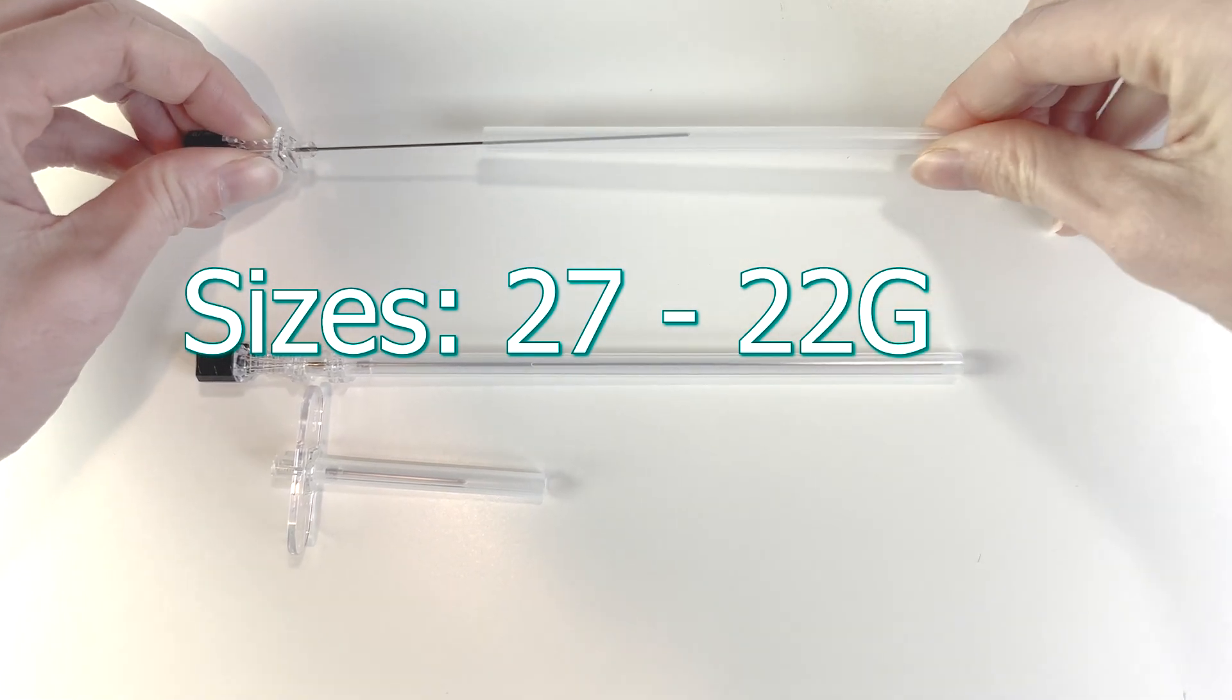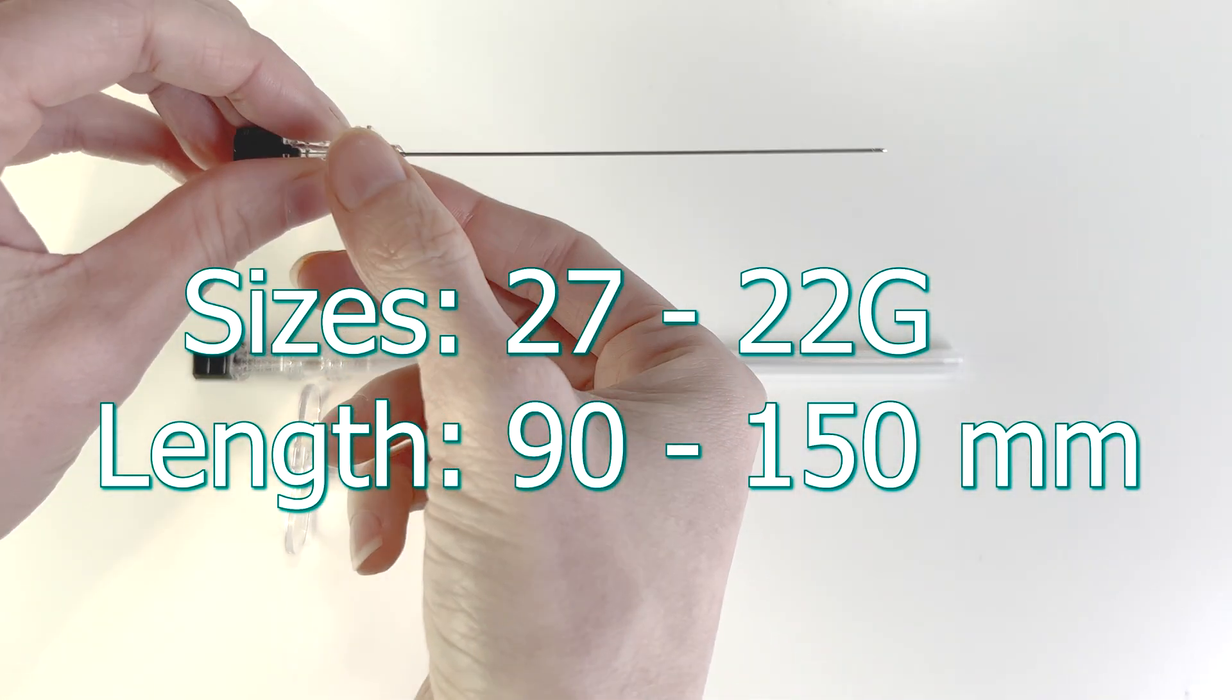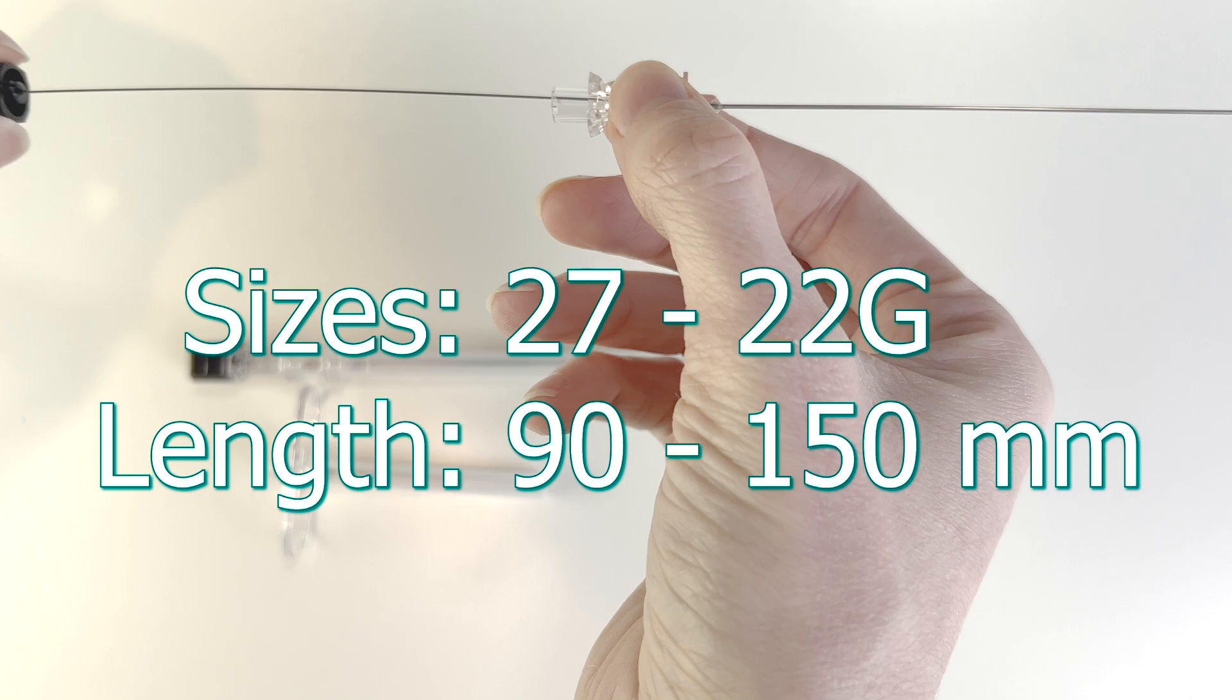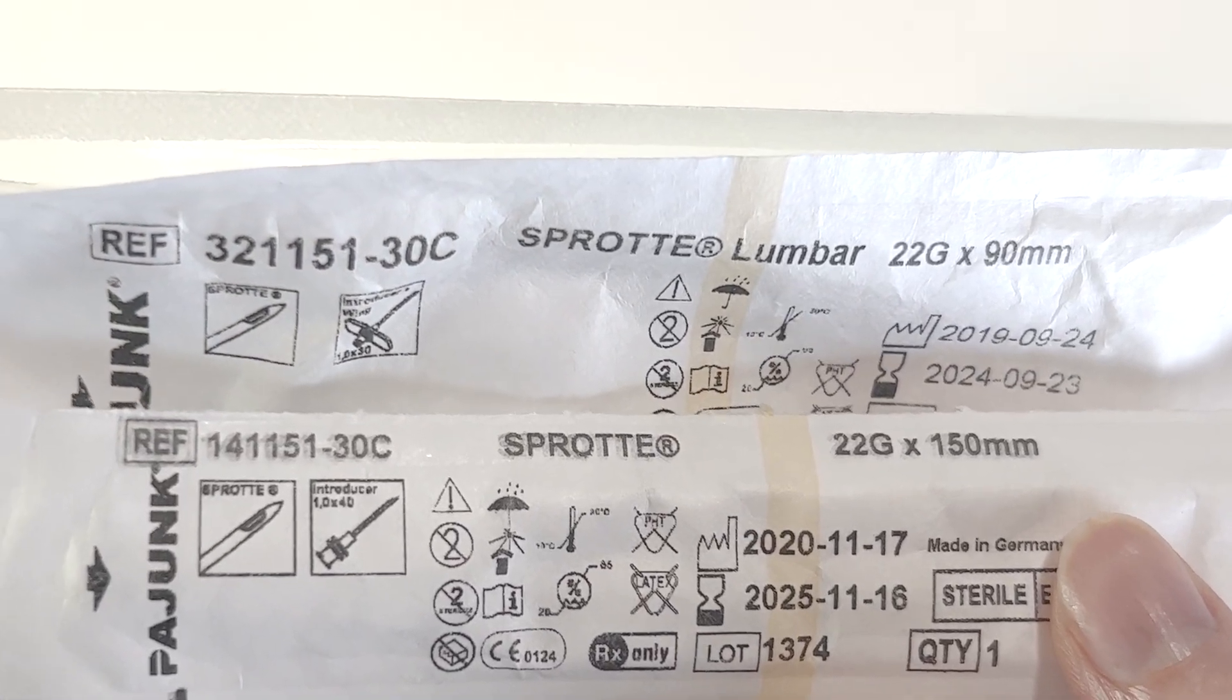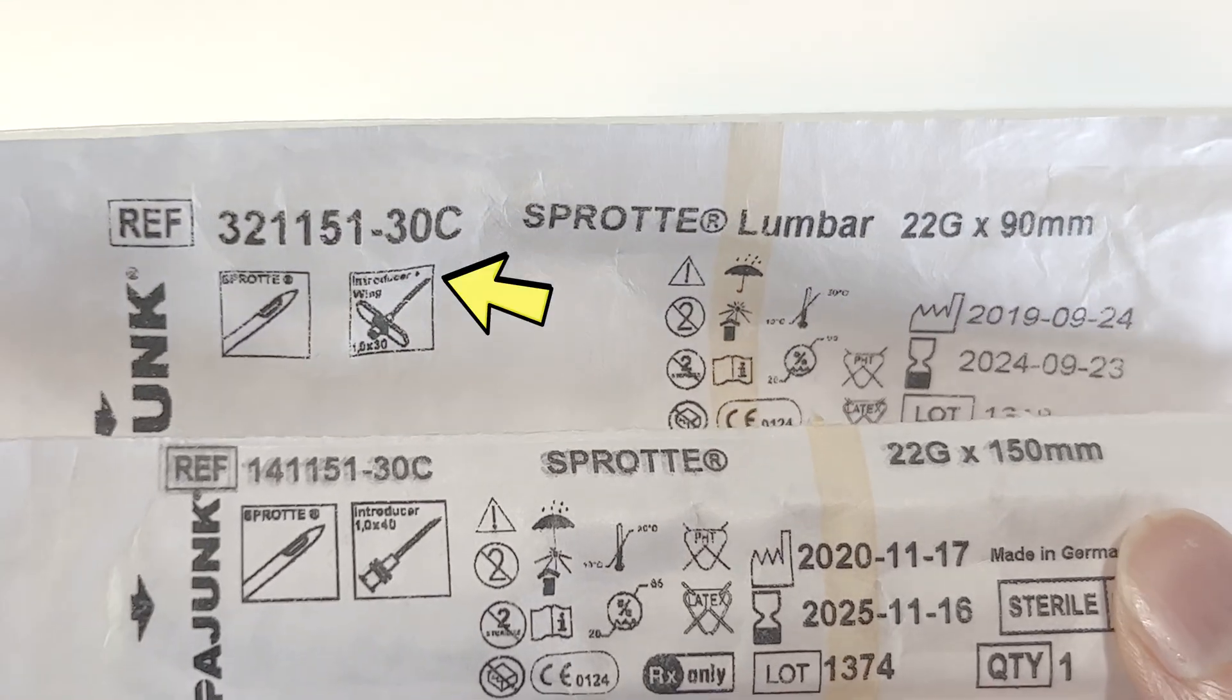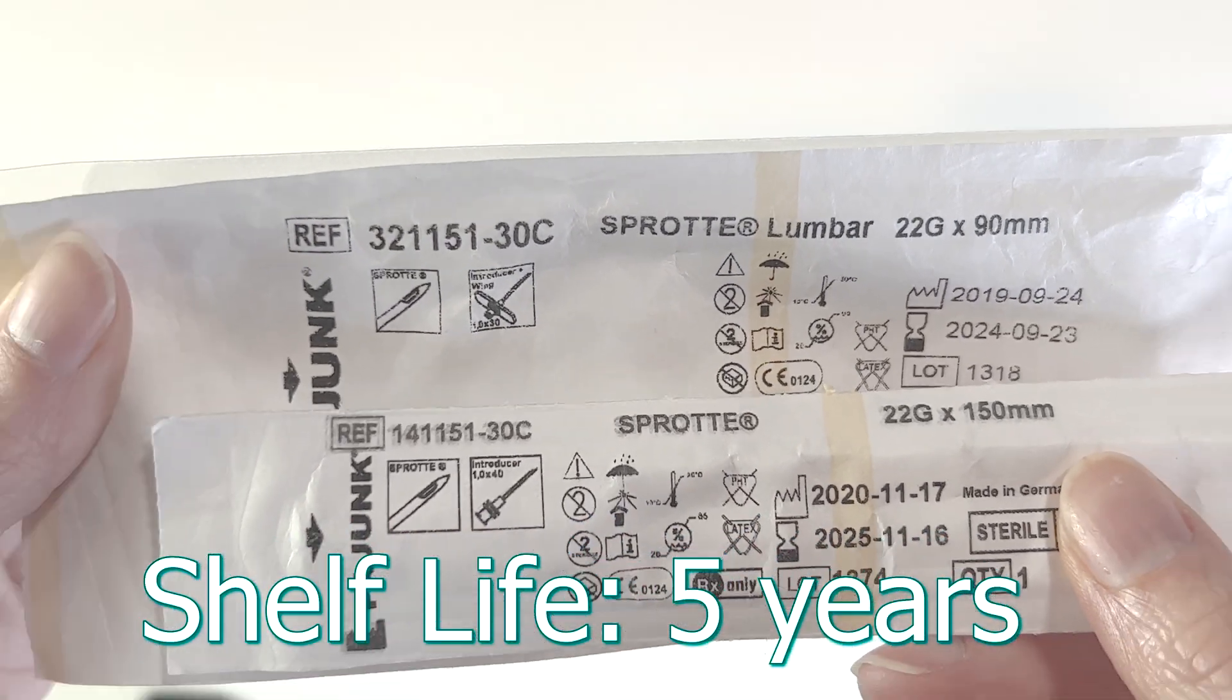It's available in sizes 27 to 22 gauge and lengths from 90 to 150 millimeters. I just want to point out that the Sprott Lumbar branded needles are the ones with the wings. This product has a shelf life of five years.